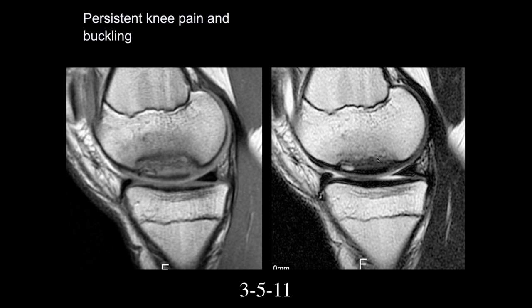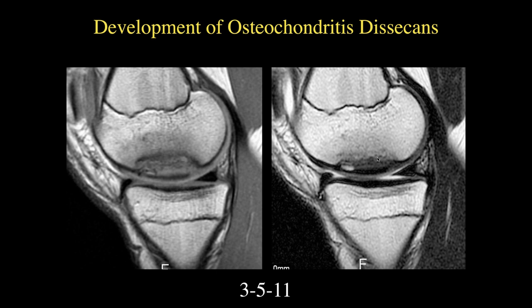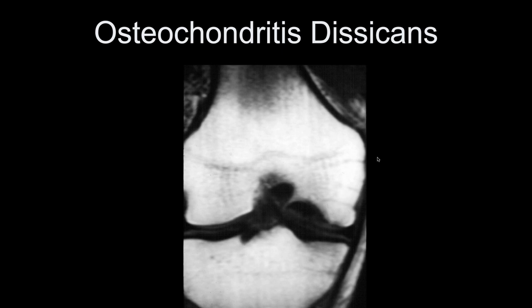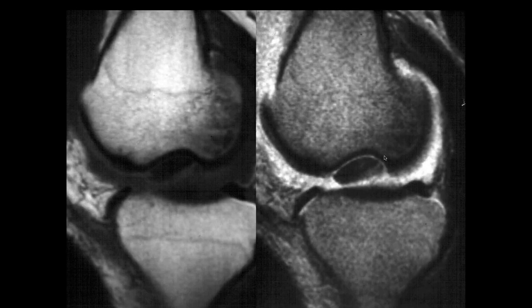These are subchondral injuries where the overlying articular cartilage is still intact because it's much more pliable. A few years later, we see fluid undercutting a separated osteochondral fragment with significant surrounding edema — an unstable osteochondral defect. The cartilage looks like it may be holding it in place. You can see how these progress over time. Osteochondritis dissecans are really subchondral fractures — with MR it's clear these are fractures, all due to repetitive trauma.